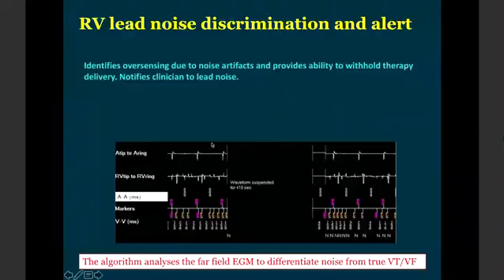You look at this. Here, this current generation device has clearly identified this as noise. This letter annotation has been sensed as a ventricular fibrillation because of the near field activity being so rapid. But the device smartly says, though it comes in the fibrillation range, it is not fibrillation, it is something else, it is noise, do not give therapy. And so this device has aborted therapy because it has rightly classified this as noise.